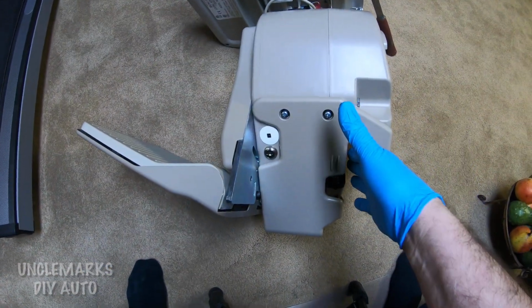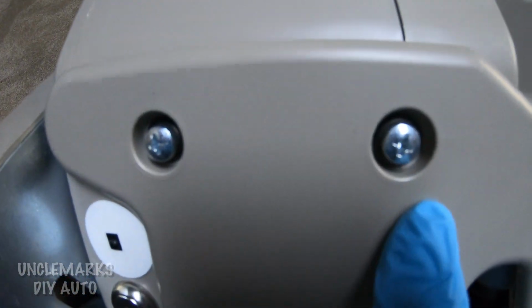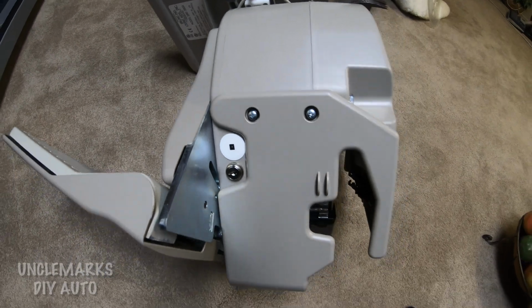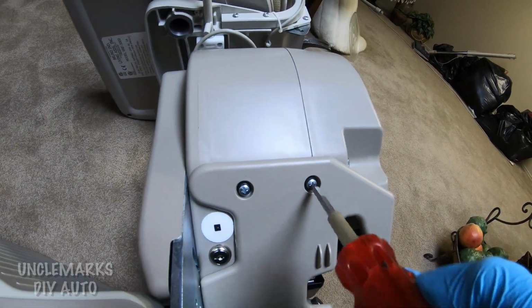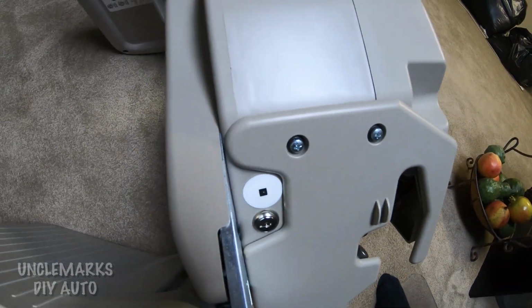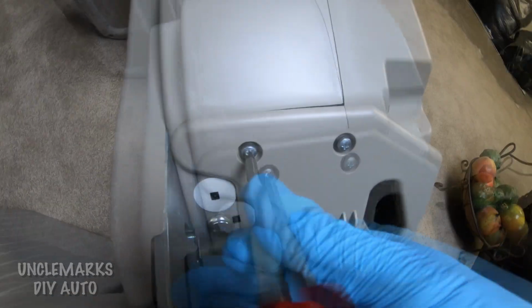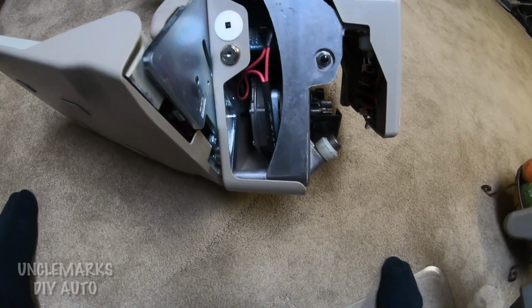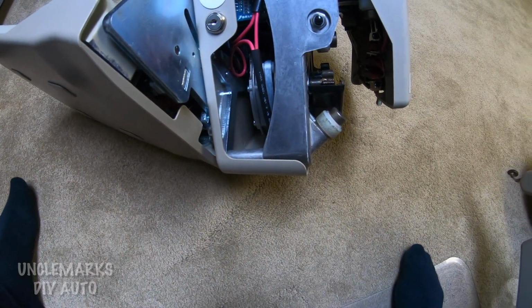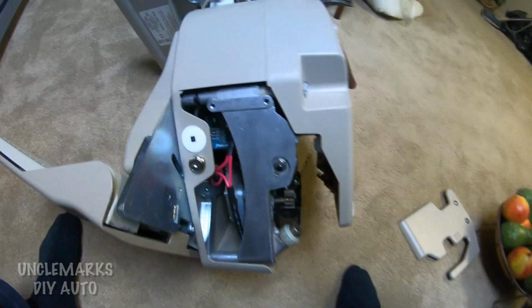This is where the track comes out. So this will be the front of it. A couple screws here. I'll take this off on this one, just see what's behind here. These are just Phillips screws. And these ones have little rubbers holding them in, so they don't have to come all the way out. It just loosens, and then this cover should come off. I was trying to find a fuse. It's a blue fuse on this thing, and no, this gives you maybe a little bit of access, but not to what I want on this unit. At least I know for next time.